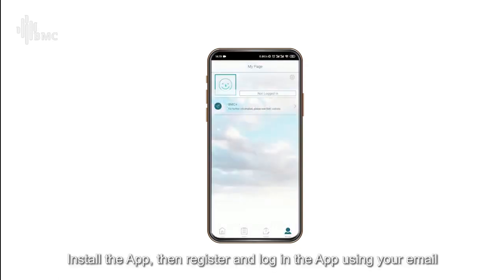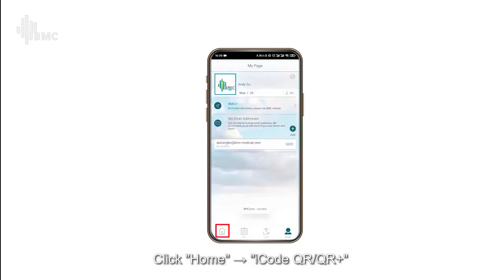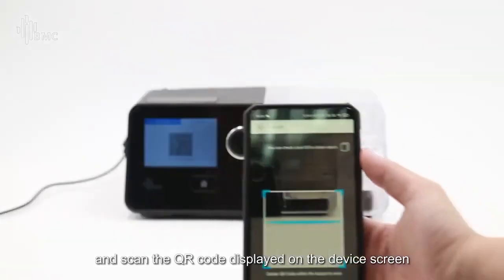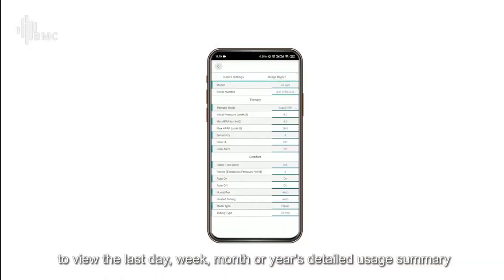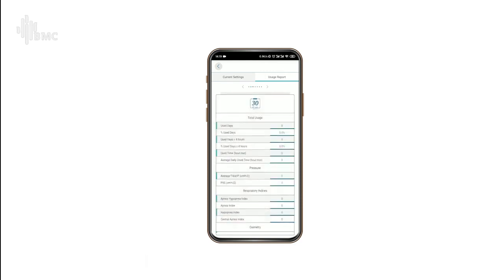Install the app, then register and log in to the app using your email. Click Home, iCode QR/QR+, and scan the QR displayed on the device screen to view the last day, week, month, or year's detailed usage summary.